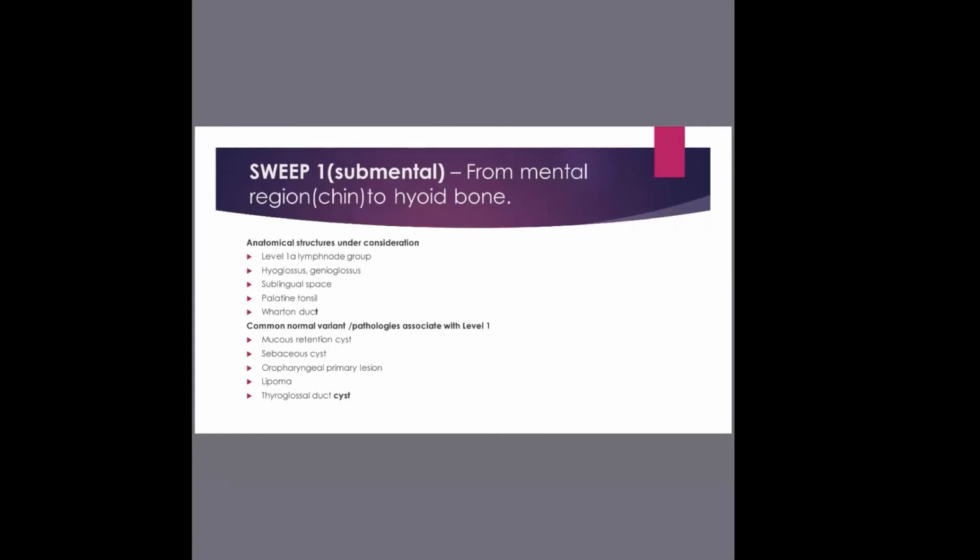We are more interested in the appearance of the thyroid. If the thyroid is enlarged, something is making it enlarged. And sometimes when the thyroid is enlarged, it's subjective. You just see that, no, this one is enlarged. It's either there are nodules in the thyroid or there's an inflammatory process going on in the thyroid.